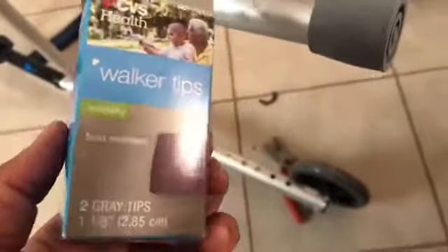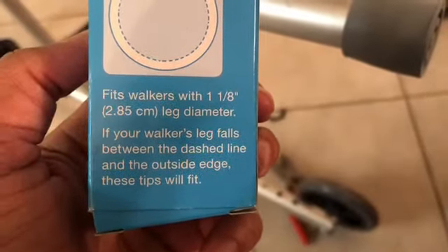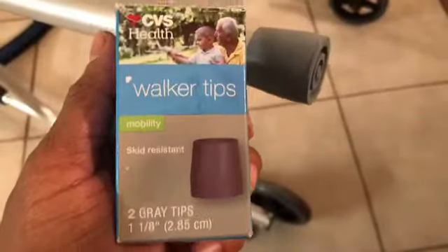There you have it. Before, it was all black, and I added this ever-built heavy duty felt pad to the bottom of it. But you can take them off because there are proper walker tips for sale. These can be purchased at CVS and they fit walkers with a 1-1/8 inch or 2.85 cm leg diameter. If your walker leg falls between the dashed line and the outside edge, these tips will fit — and mine work, or rather my mother's work.